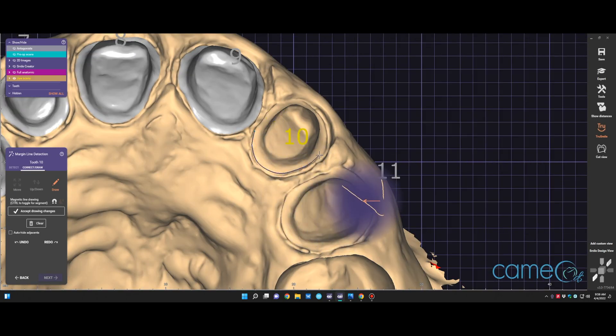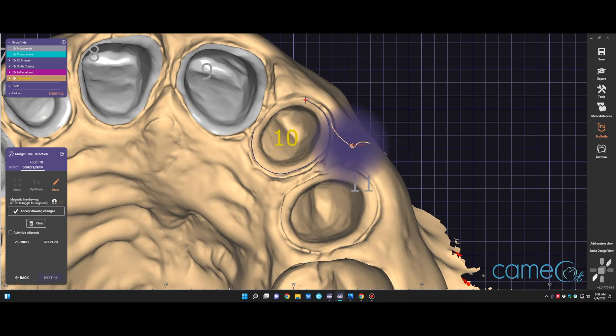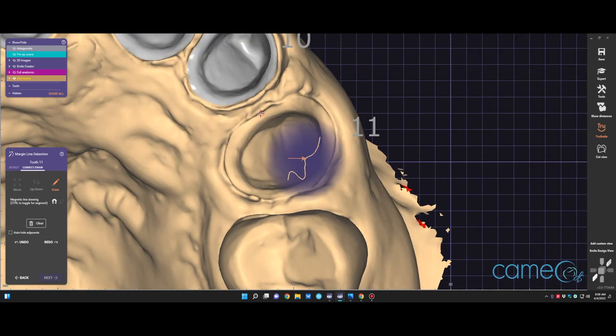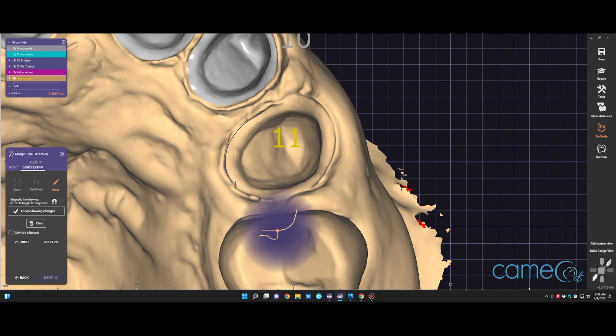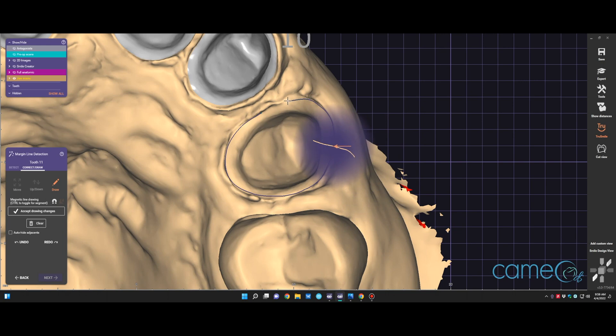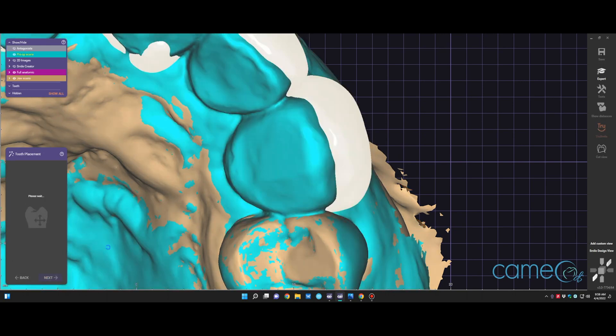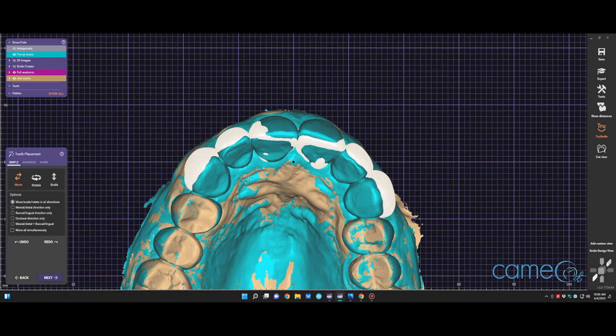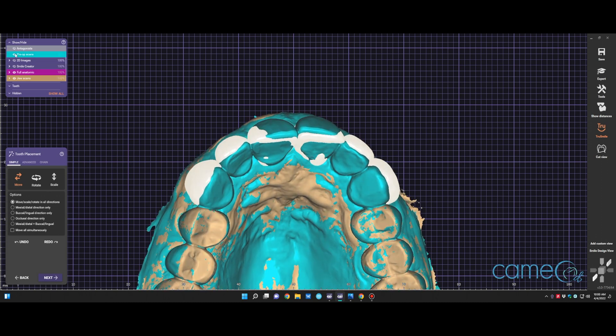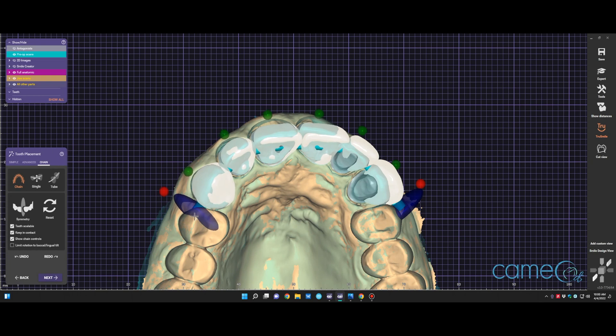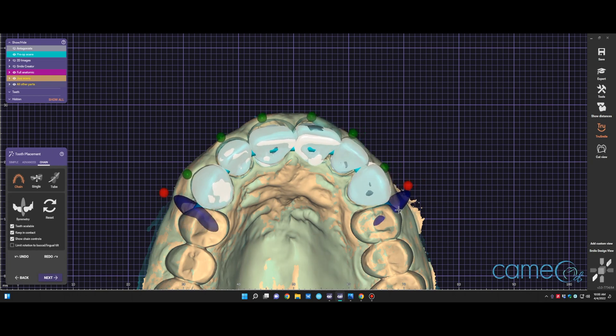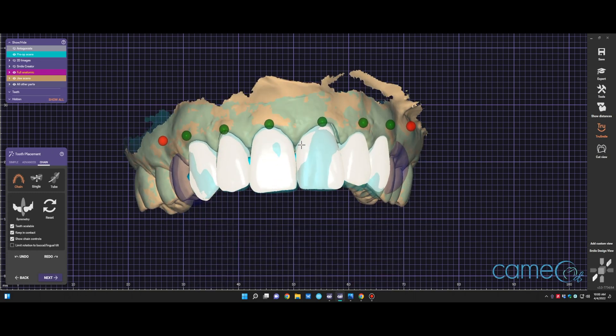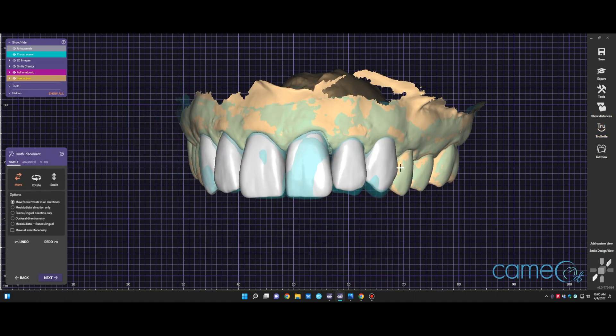You noticed how it jumped. If I click the wheel on the mouse, wherever the cursor is, it will center the screen on that. So that's why it jumped quickly there a second ago, because I just put the cursor where I wanted it and then clicked on the wheel and it centered the image there. Okay, so now we have those outlined and it allows to move the teeth. You can do it in the chain mode, which gets you in the basic position and all the teeth will move and resize together. And you see what we did there. We set the distal contacts and then position the anterior teeth.